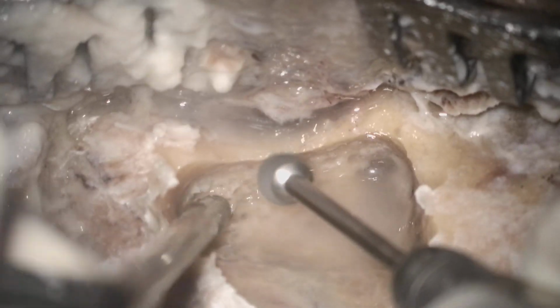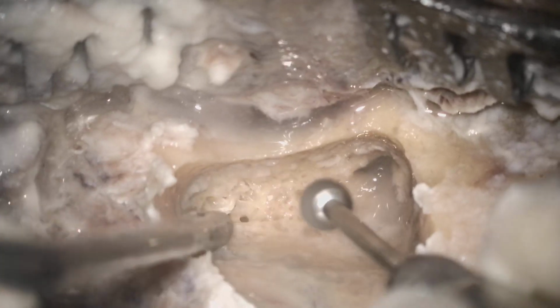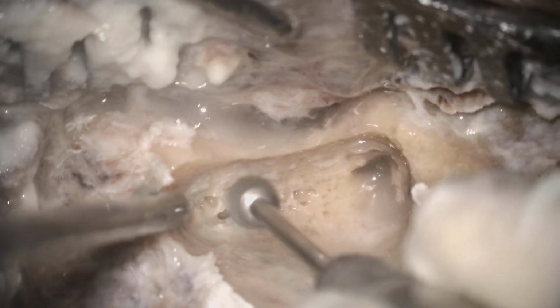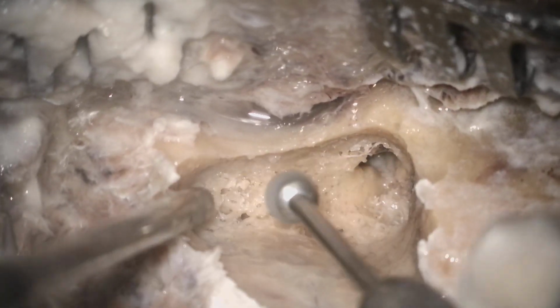You have to just continue your drilling. You have to just remove all the cells over there. All right. Okay. This digastric ridge is a fantastic landmark for the facial nerve. So whenever you are doing the surgery, you have to identify the facial nerve from behind.